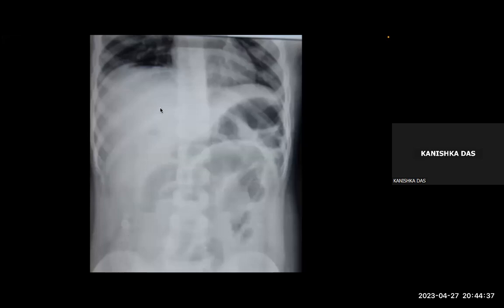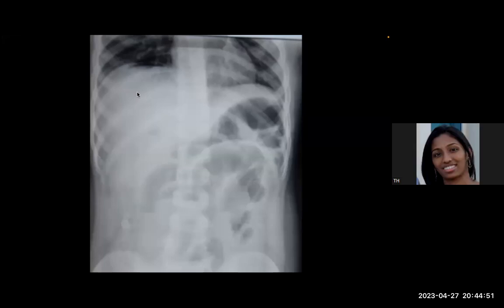Tell me another diagnosis. Suppose a similar thing you see in the newborn period. Another diagnosis. Newborn, sir. Calcification here and this pattern, hardly any levels here. Meconium peritonitis. Meconium peritonitis, ileal perforation. So this was of course appendicular. It was in an older child, an appendicular perforation.